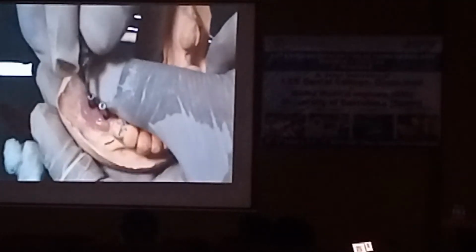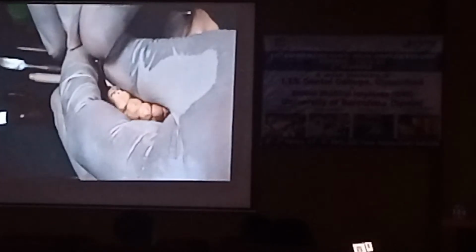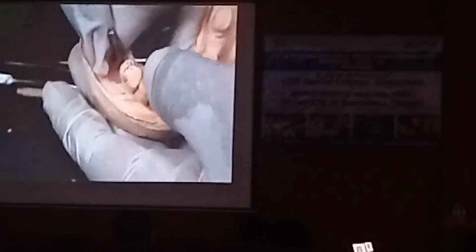See this, even the X is deformed, right? Sir, there is a question from the internal side. Okay. See, yeah, there is a question from the internal side. Right? Please go ahead. Sir, there is a big structure. I think this is a tissue, gingival tissue. Yeah, gingival tissue, the gingiva.